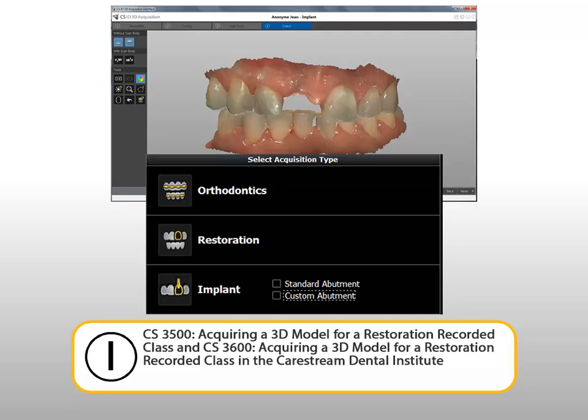For additional information, see the CS3500 Acquiring a 3D model for a restoration recorded class, and the CS3600 Acquiring a 3D model for a restoration recorded class, in the CareStream Dental Institute.